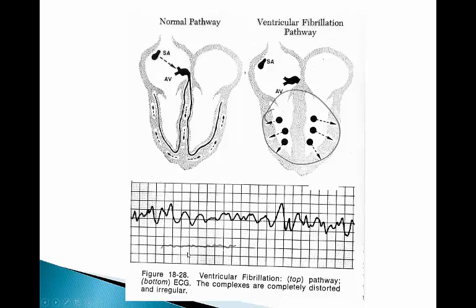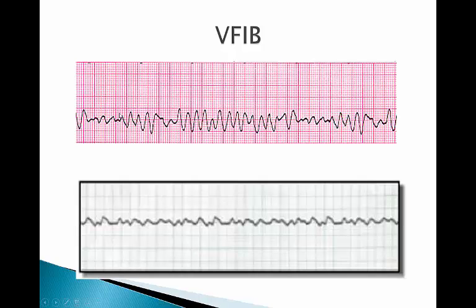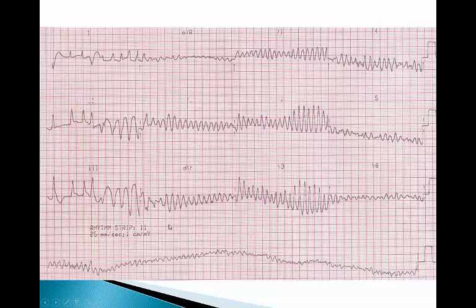You can't count anything, you can't measure anything, and if you don't defibrillate, the patient probably will die. Well, there's no doubt about it. The patient will die. And by the time they hit VFib, it's actually very difficult to get the patient to come back to life once they have ventricular fibrillation. So, all right, there's just another strip. There's the 12-lead EKG. That's not so good either. Nobody wants to see that either.